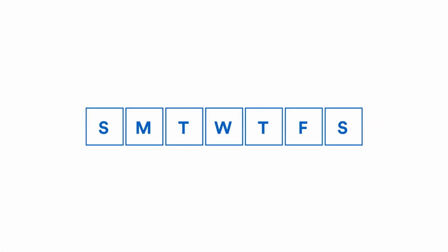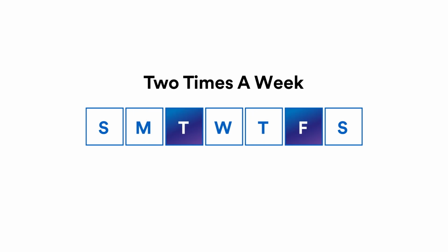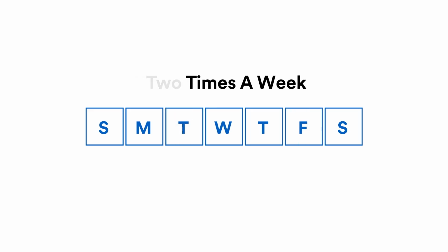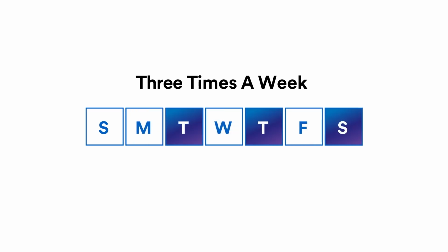It is recommended to reapply 3M Cavilon Advanced Skin Protectant 2 to 3 times per week. For best results, create an application schedule such as Monday, Thursday, or Tuesday, Friday for 2-times-per-week application, or Monday, Wednesday, Friday, or Tuesday, Thursday, Saturday for 3-times-per-week application. More frequent application can result in product buildup on the skin.